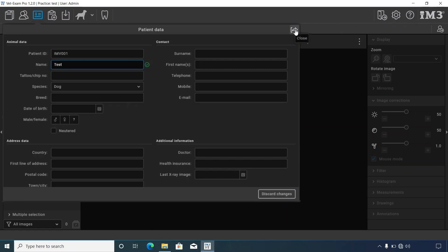When selecting close, this will save the new information and exit back to the main screen.